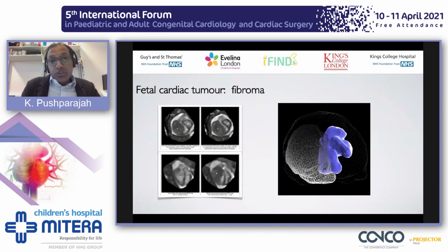The other thing, of course, is things like cardiac tumors, and this fetus had a fibroma, and you can see the extent of the fibroma. But what's important is that we were able to delineate the potential obstructive nature of that on some of the outflow tracts. And here, despite the size of the lesion, the RVOT was actually relatively patent.